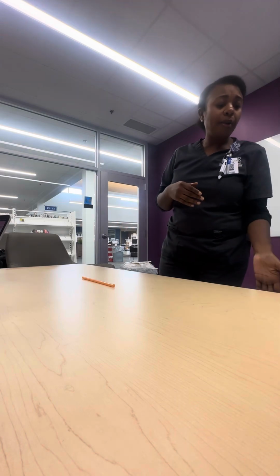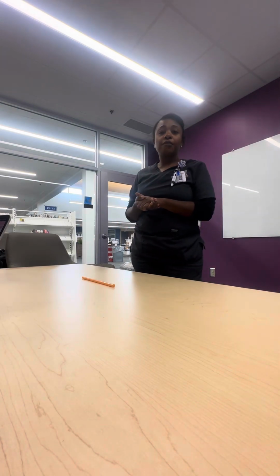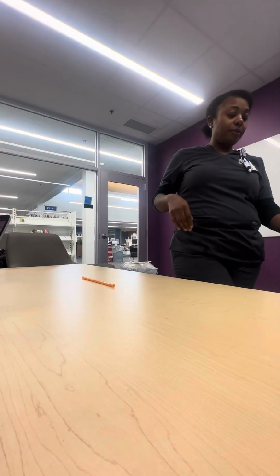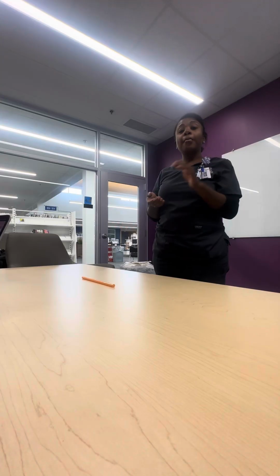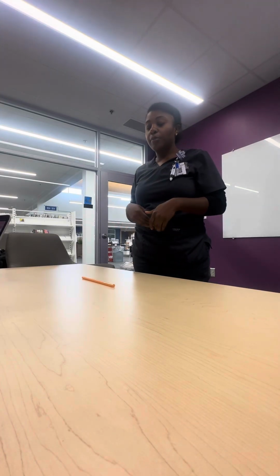Okay. All right, I'm gonna raise your bed. Do you have any allergies that I need to be aware of? Okay, great. I'm gonna raise the bed to waist height, and I'm gonna also lock the bed. Okay, so today I will be performing a Foley catheter. It should release some pressure if you have any on your bladder.